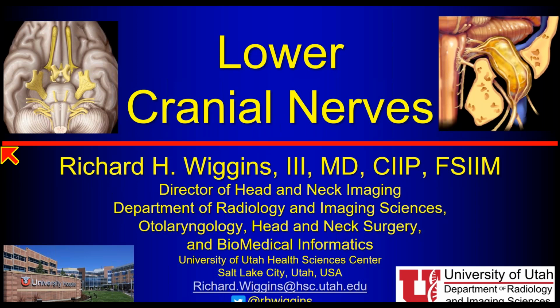Some of the clinical presentations are very complicated here. If we think about, for example, a patient that has pulsatile tinnitus, we want to think about the vascular entities that may have an imaging finding with pulsatile tinnitus. So if we think about a jugular paraganglioma, a glomus tympanicum, a dural AV fistula, an aberrant carotid, a persistent stapedial artery, or a dehiscent jugular bulb, if we think about one imaging study that includes all of that anatomy and pathology, usually we're either doing a contrasted CT or a contrasted MR with thin sections.